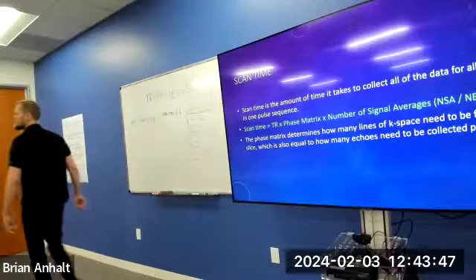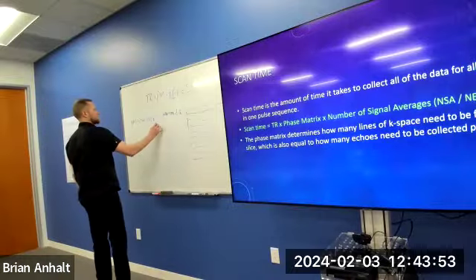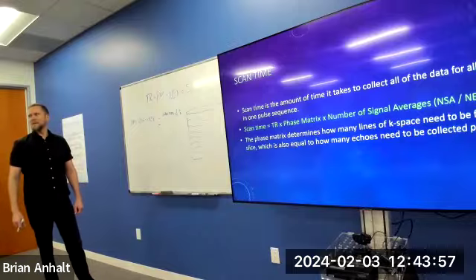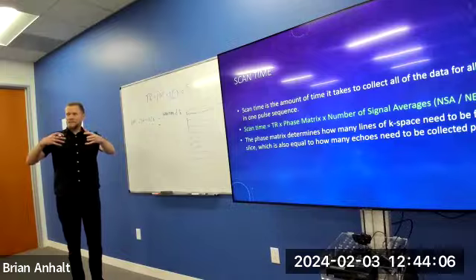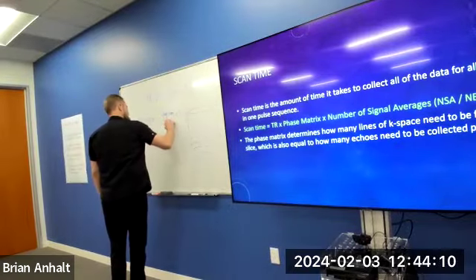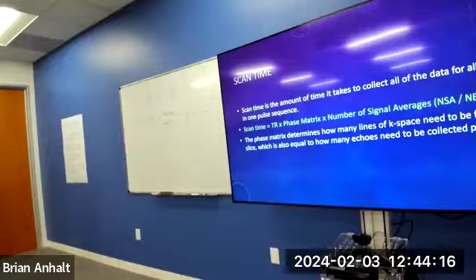What else happens? SNR goes down. Does it go down? The size of the box is bigger. Remember, I'm cutting into less pieces now, so that voxel gets bigger, right? So SNR goes up by how much? Goes up by 2, right? It doubles. Since the voxel size doubled, the SNR doubled.